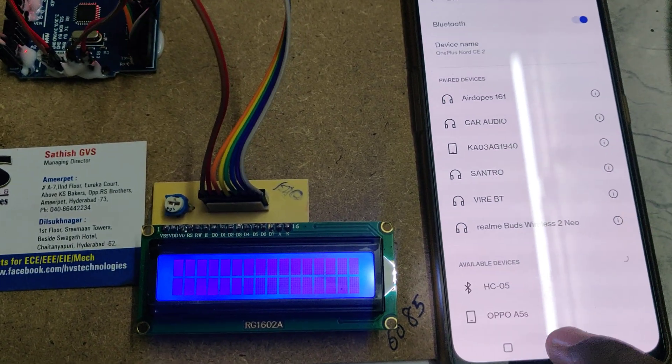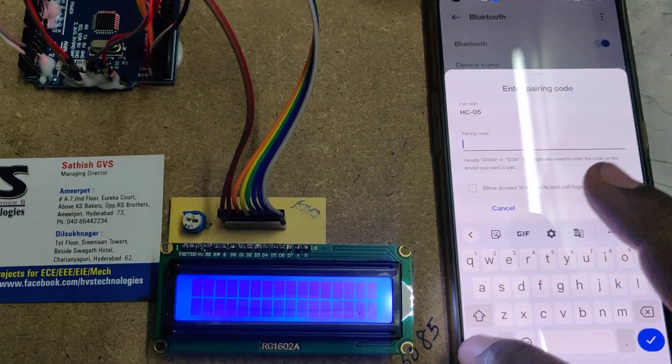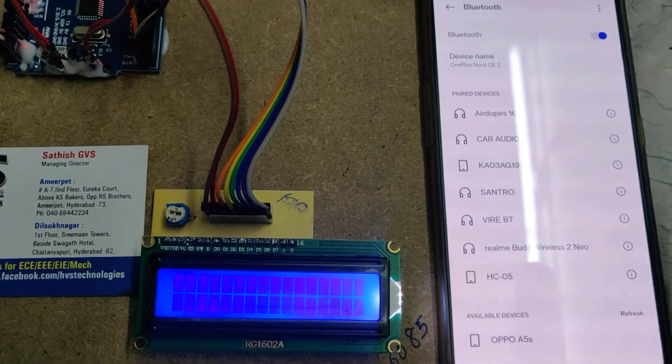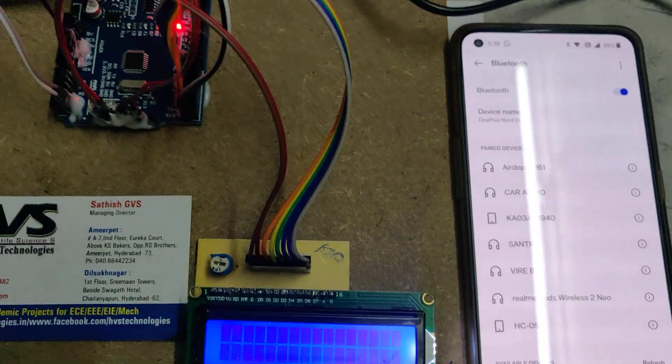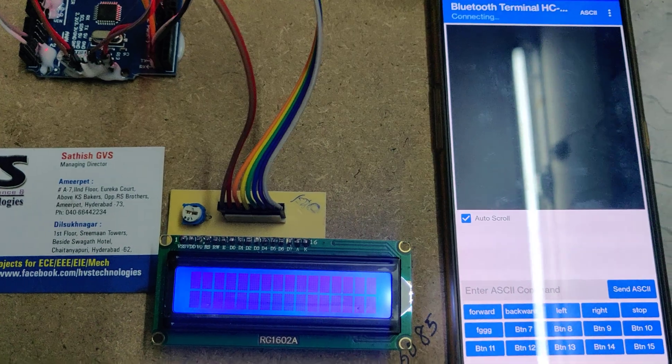Wait and it will show the HC-05 device. This is a first-time setup on your mobile phone. Once paired from settings — the password is 1234 — it will be saved in your history. The next time onwards you can go directly to the application and select HC-05 to connect.